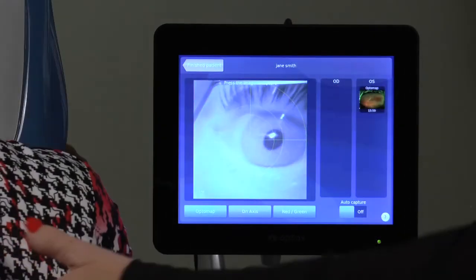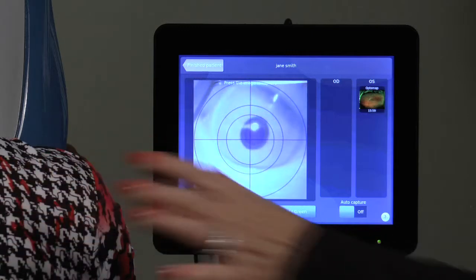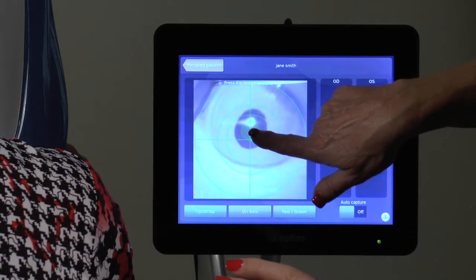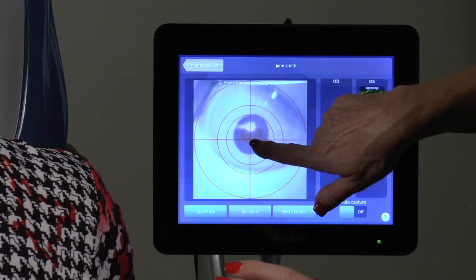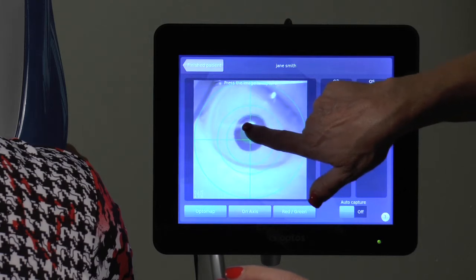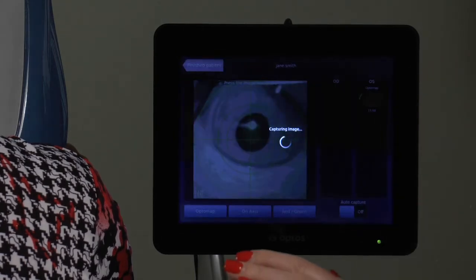The alignment circles and crosshairs will start out blue as the patient moves in, then change to green when close enough on the Z axis. If they turn red, the patient is too close and should be instructed to move back slightly. When the circles are green and the pupil is centered on the crosshairs, ask the patient to open both eyes wide, then tap the center of the screen to capture.